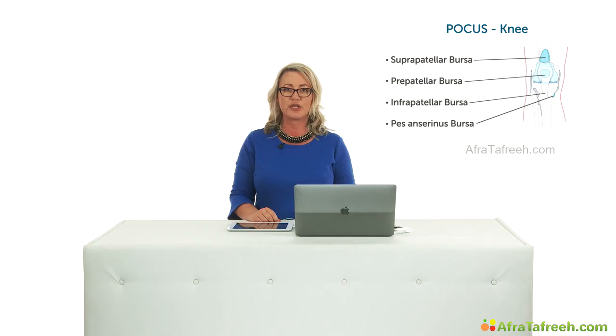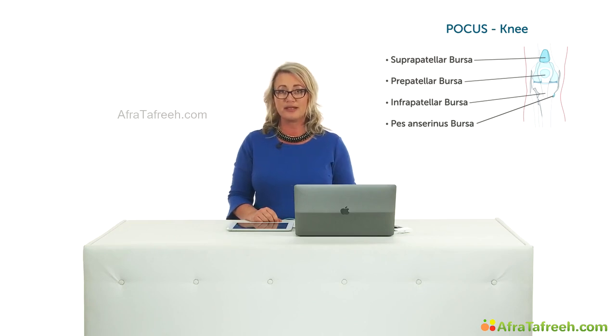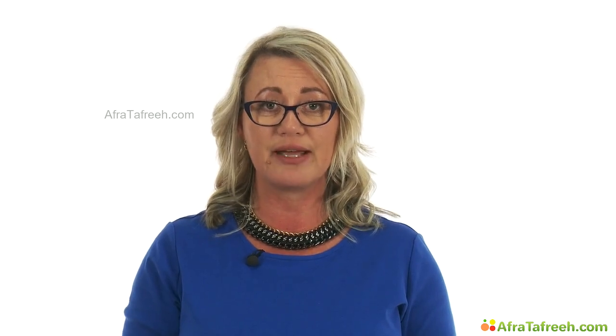Ultrasound can be helpful in determining if the swelling in the knee is an excess amount of fluid in the bursa, and even be used to guide a needle to take a sample for diagnosis by pathology. This sample not only helps reduce the pressure on the knee for the patient, but can be used for diagnostic purposes to rule out infection, for example, gout.